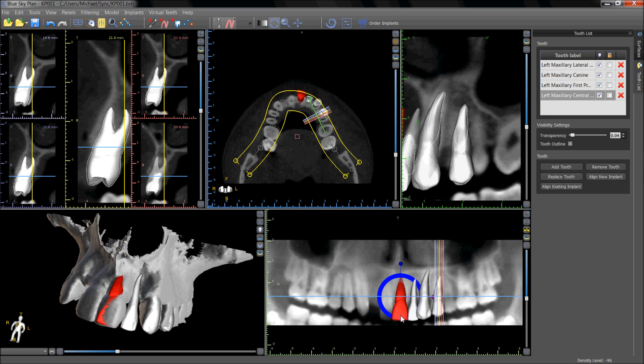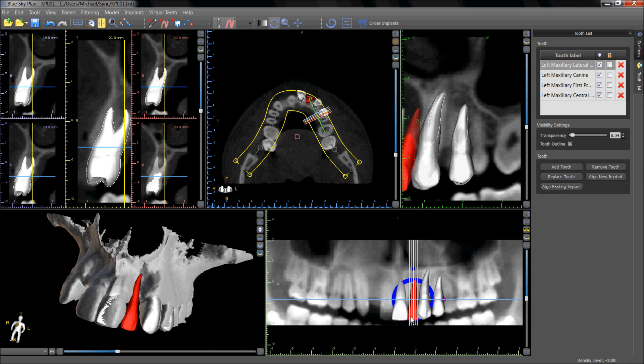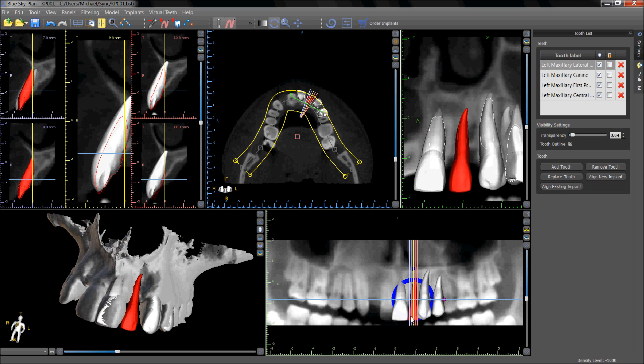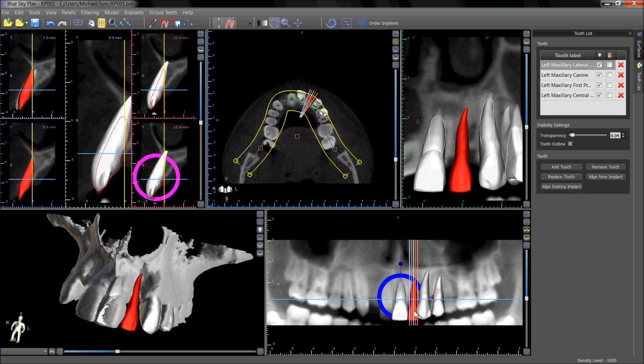Clicking on a tooth makes the tooth active for resizing or rotating, and double clicking on the tooth centers the tooth in all the views on the screen.